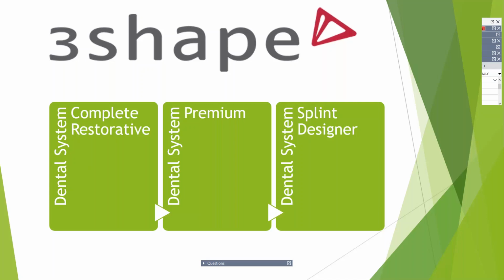Let's say you only have the Dental System Crown and Bridge package. That's okay. You can actually add on the Splint Design module, which will get you full access to the 3Shape Splint Studio. So you have three options here. They're all at different price points. And if you don't already have 3Shape, I recommend looking at each of these to try to determine what is going to best suit your laboratory.